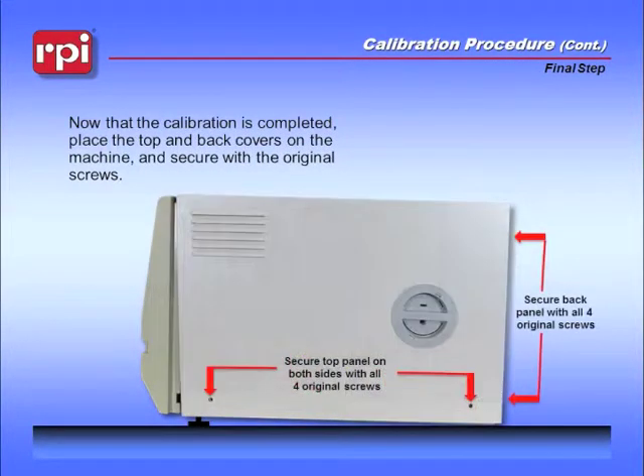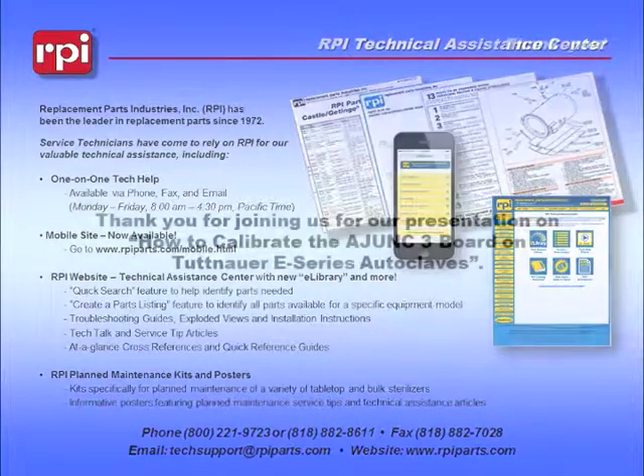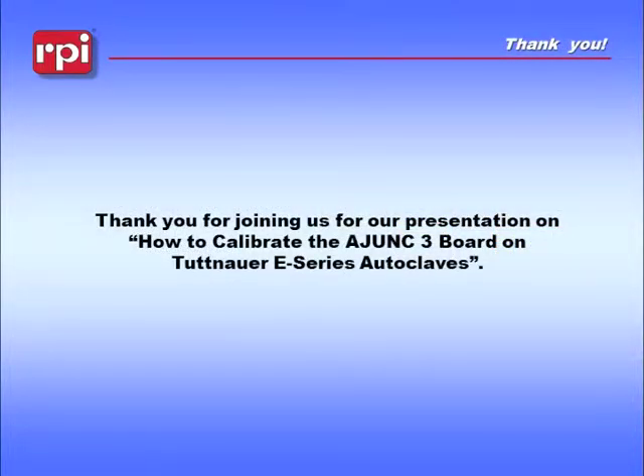Now that the calibration is completed, place the top and back covers on the machine and secure with the original screws. RPI offers free technical assistance by phone, fax, or email. Our website offers a comprehensive e-library of service tips and technical articles, troubleshooting guides, and videos like the one you just saw. We also have a mobile site as well as a shopping cart. Please feel free to contact RPI for any of your technical support needs. Thank you for joining us for our presentation on how to calibrate the Adjunct 3 board on Tuttenauer E-Series Autoclaves.